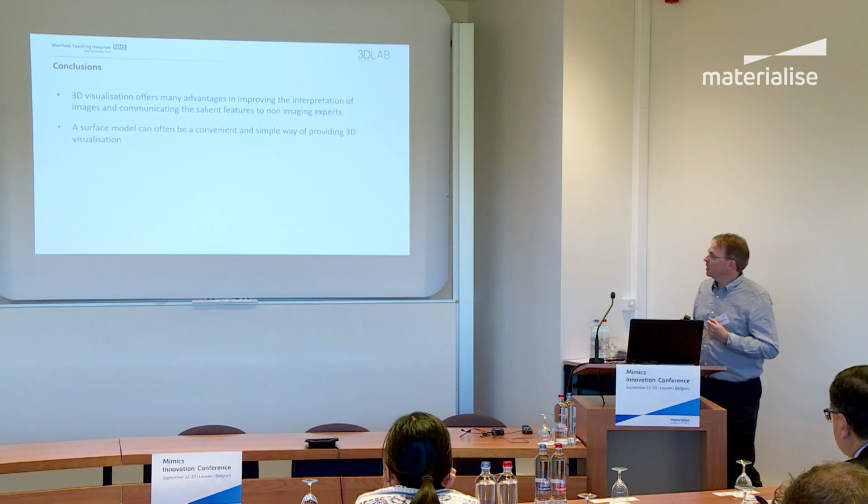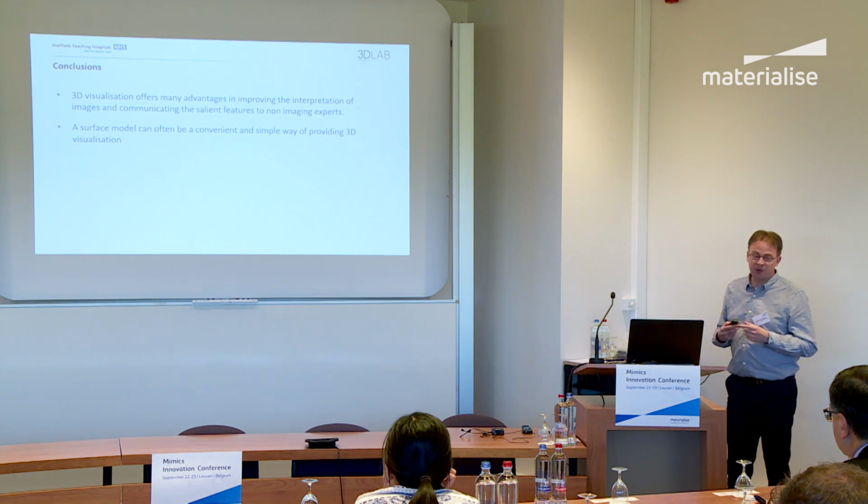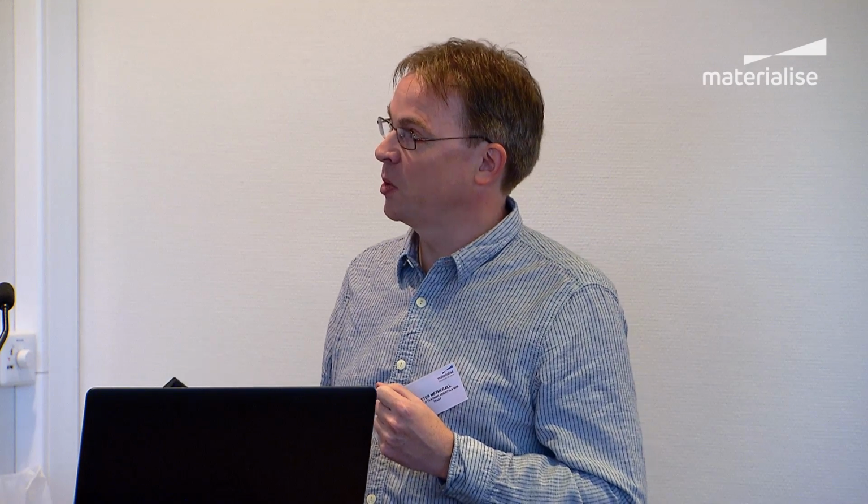So just to conclude, the visualization offers many advantages and is a brilliant way of communicating this to non-imaging experts. A surface model is a very convenient way of doing this, but requires accurate segmentation. And that's where we feel having a 3D imaging lab based in radiology is an excellent way of achieving this. It offers methods of extracting quantitative information from the images which are not possible from the images alone unless you produce a segmented model from it.